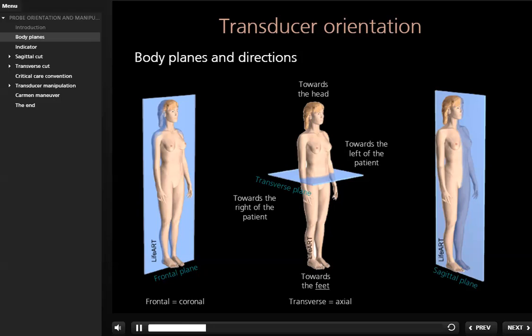Knowledge of cutting planes of the human body is essential for the ultrasonographer. In this course, we give preference to the use of the terms sagittal, transverse, and frontal.